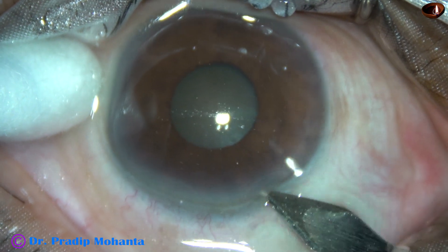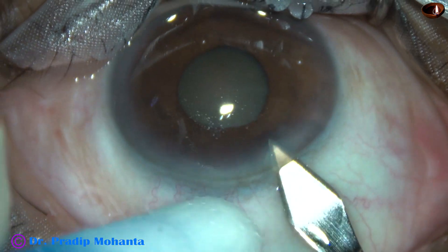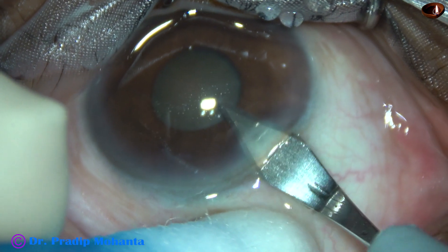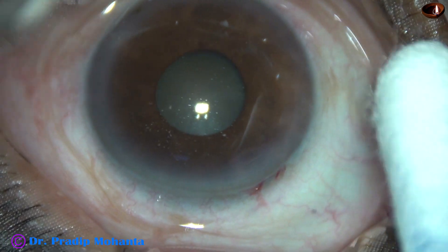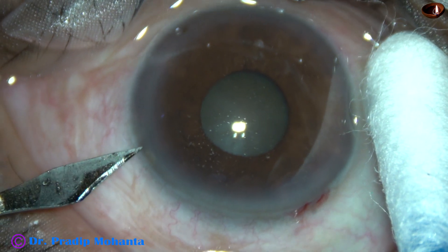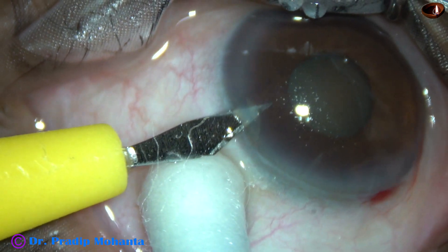This is the main incision with a 2.8 mm steel keratome at around 135 degrees. And now a side port — this is a side port about 3 o'clock away from the main incision.